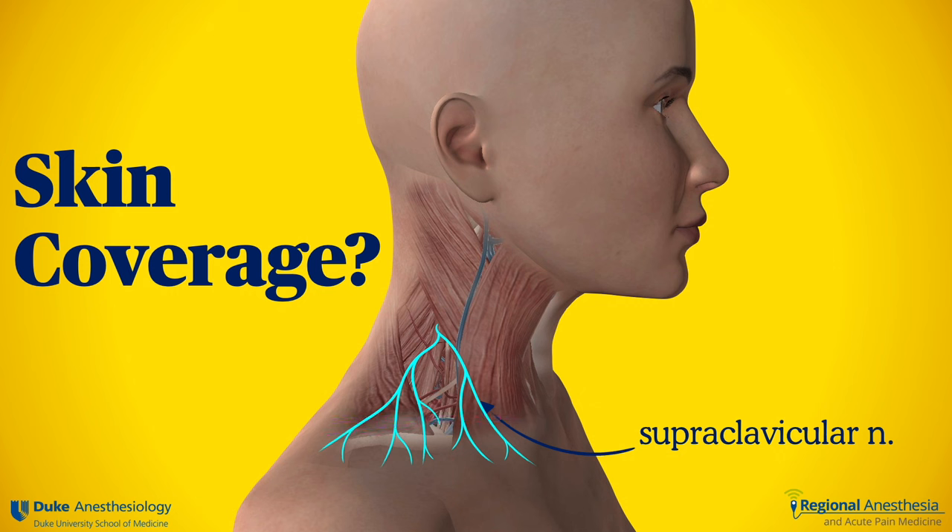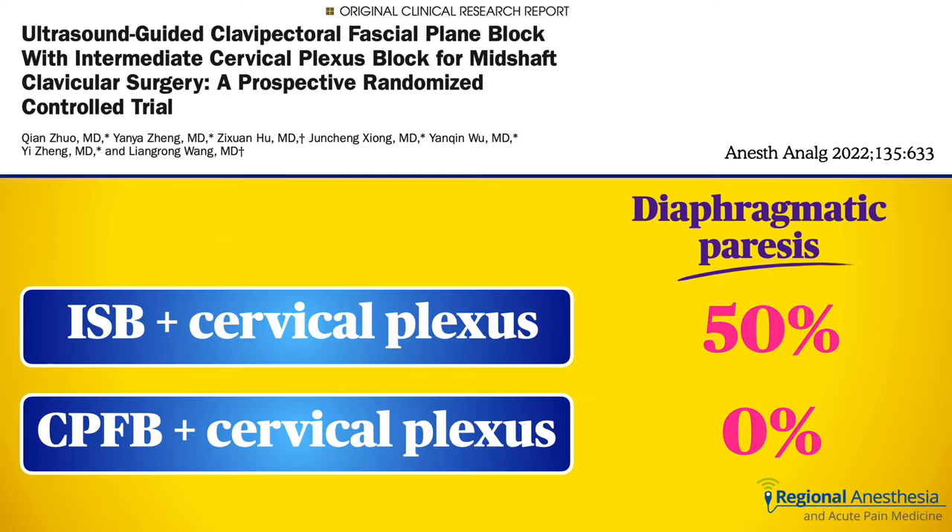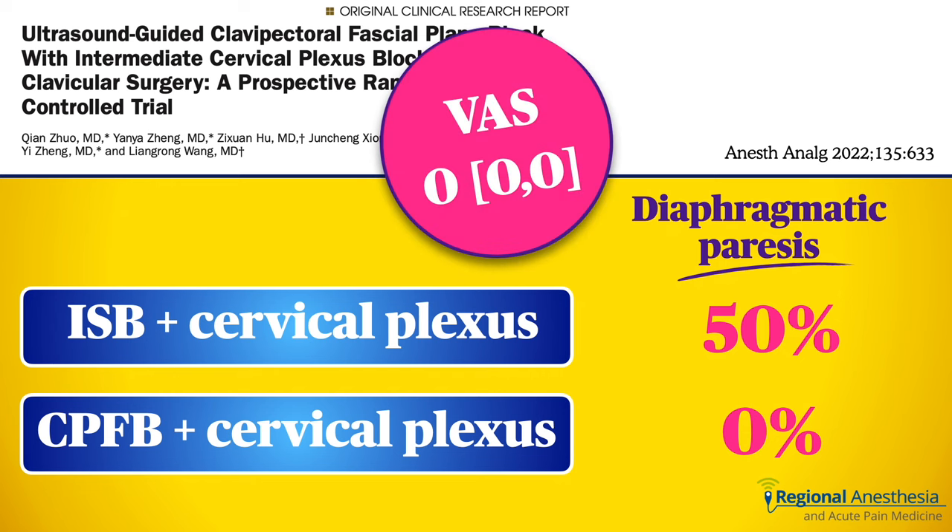The surgeon can also infiltrate the skin easily. Alternatively, a supplemental cervical plexus block has been shown to be a good combination technique. In fact, compared to the default plan of interscalene plus cervical plexus, the clavipectoral plus cervical plexus spares the diaphragm completely — not so with interscalene. Interestingly, in this study, pain scores after surgery were zero in both groups, highlighting not just the safety but the efficacy of this technique.